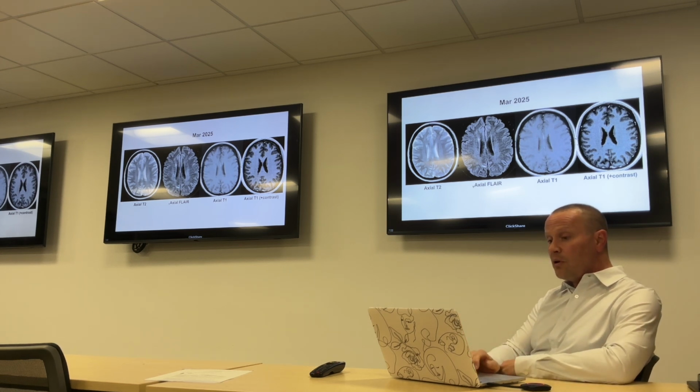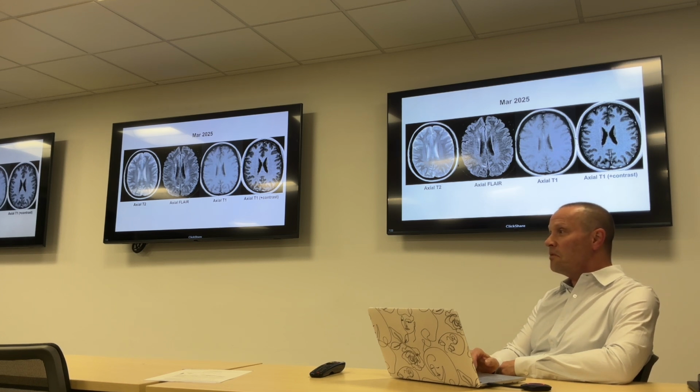So in this case, in the posterior paramedial right parietal lobe, usually the parietal lobe is more for sensation. This is close to the occipital lobe where the vision is, but I wouldn't really expect this to affect vision. If it was going to cause symptoms, it could cause numbness or something like that, probably in the left side of the body. But I would hate to be pinned down and asked what this lesion is going to do, because I can't really tell. I'd be lying, and I think most people would be exaggerating if they thought they could predict exactly what a given lesion would do.